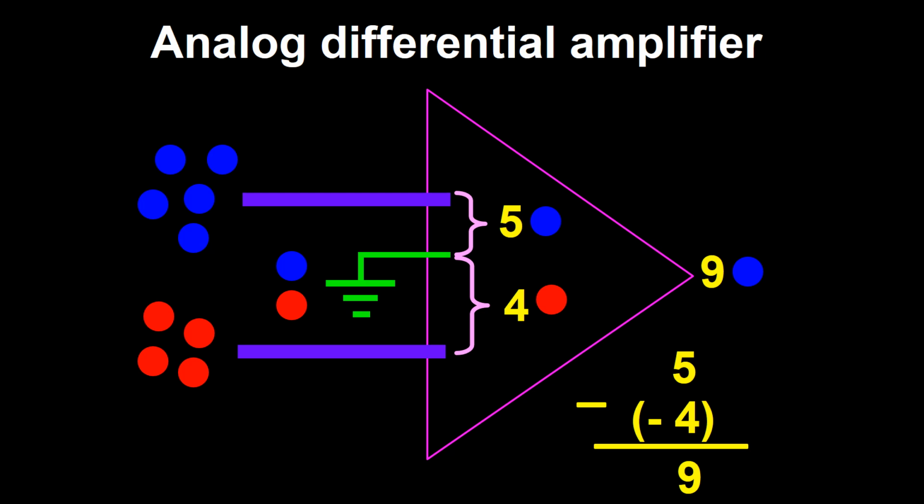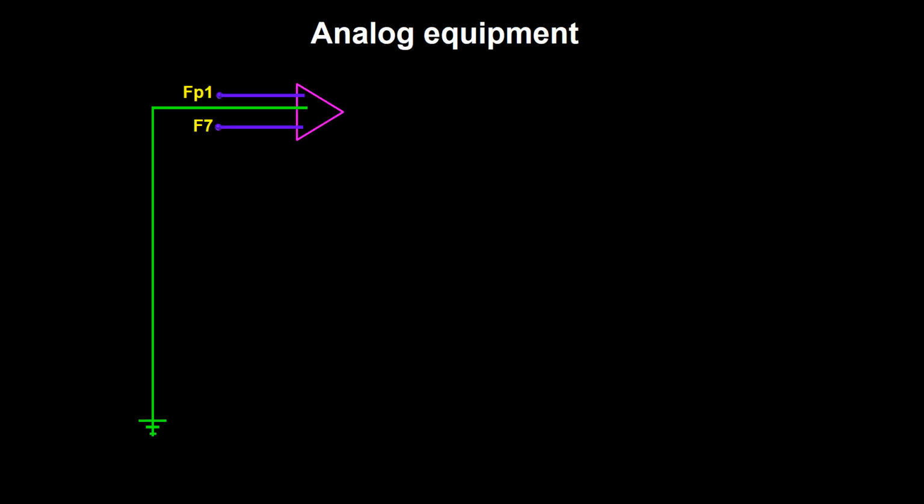I will, in the following frames, label each electrode using the conventional EEG nomenclature. So we are going to make the one on top FP1 and the lower one F7. This new diagram is nothing more than the diagram I have just presented but made smaller. In this frame I am introducing the derivation they constitute.